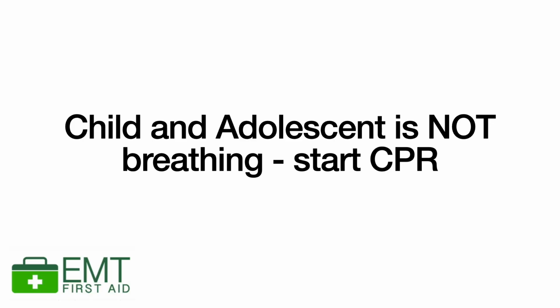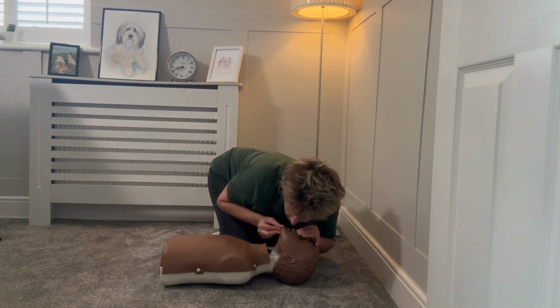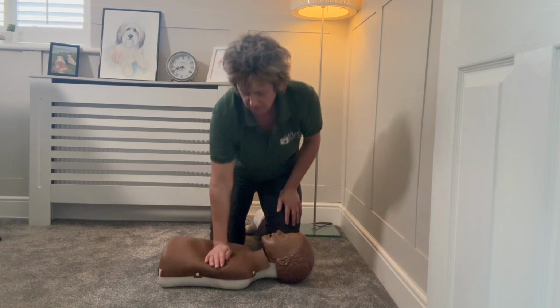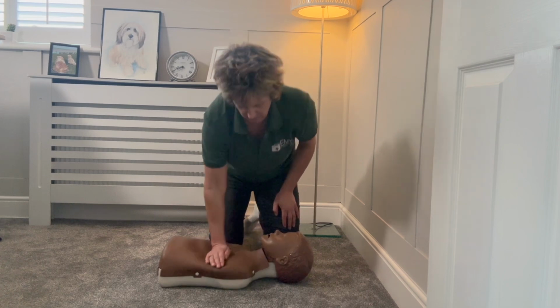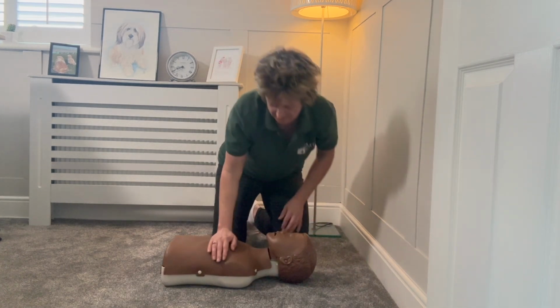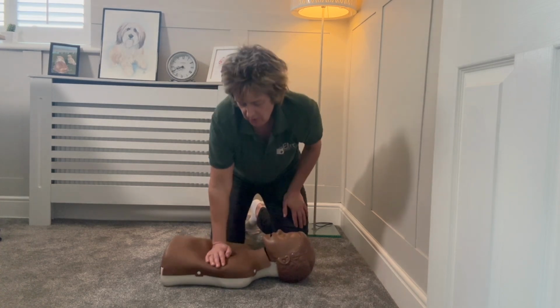While we're waiting for our helper to go and get the defibrillator and call the ambulance, we are going to start CPR. So 5 initial rescue breaths, and then we're going to do 15 chest compressions and 2 rescue breaths. And we're going to keep on going until that helper arrives with the defibrillator or the ambulance is there to take over from us. Now, with an adolescent, we're going to push down 5 to 6 centimeters for a chest compression, whereas a child, we're pushing down 1/3 of their body depth.